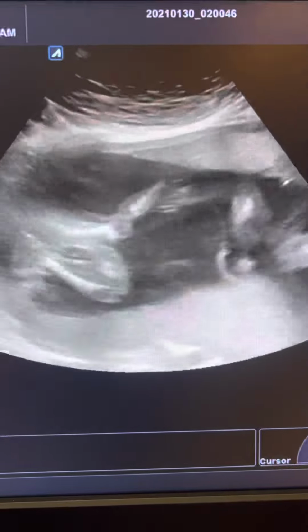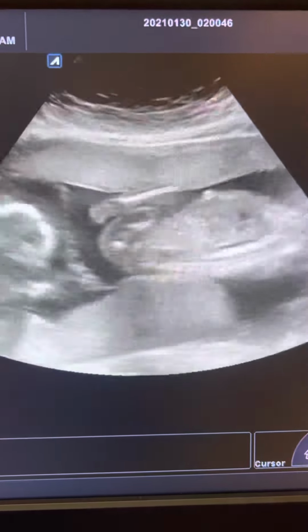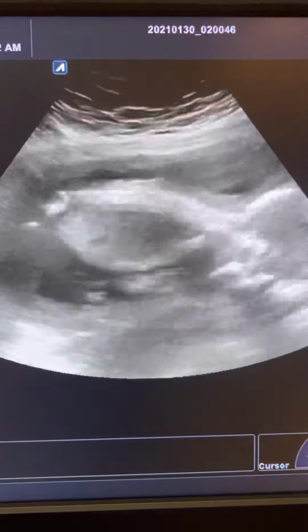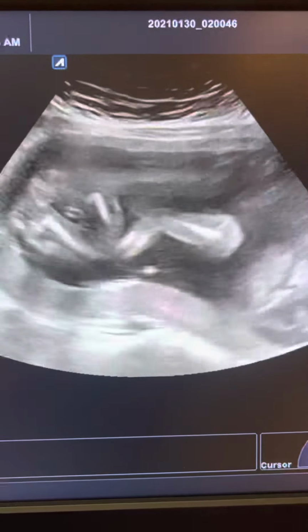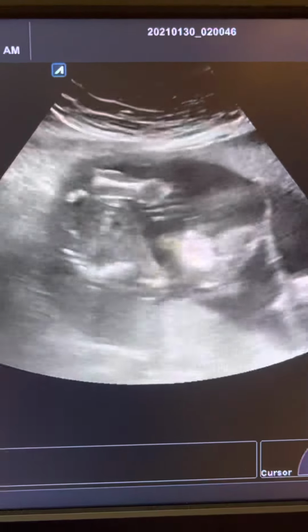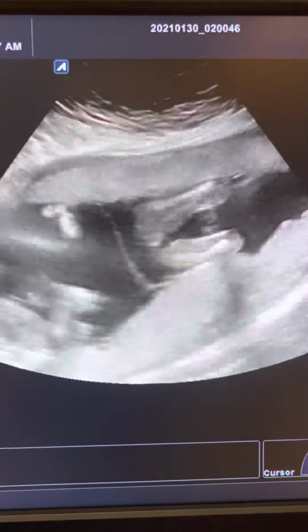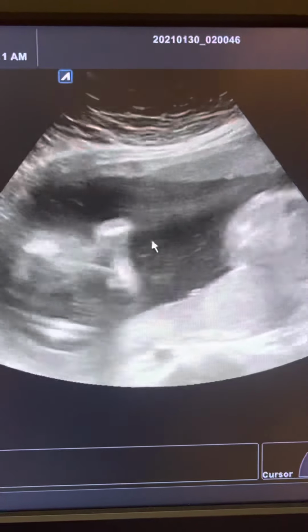We have a patient with triplet pregnancy. At first, we will look at an overview of all fetuses in every multiple pregnancy. It does not differ with the age of the fetuses. First of all, we will have a review without any magnification.